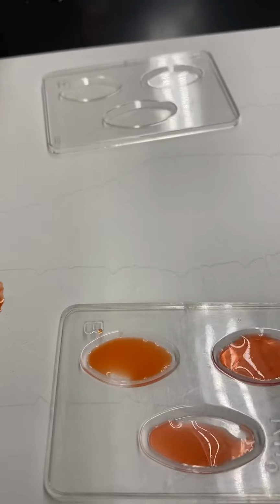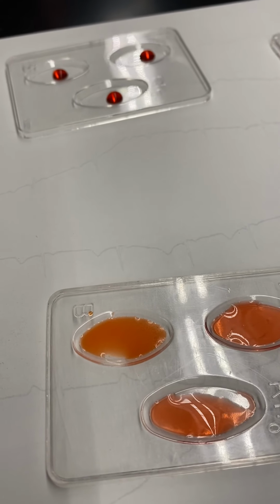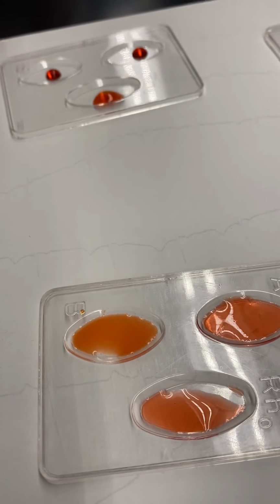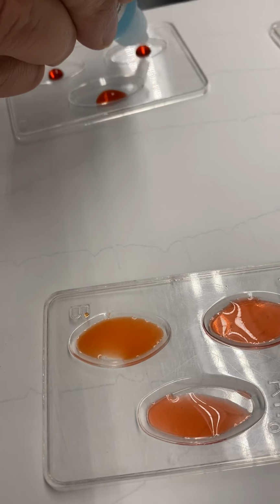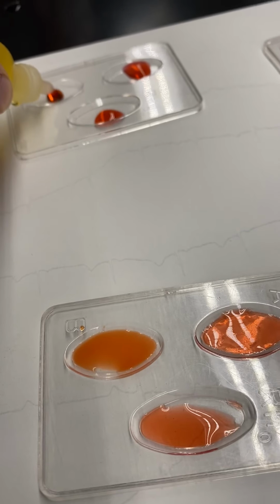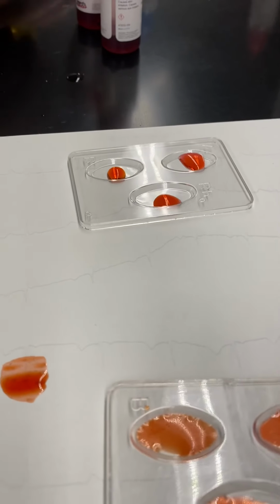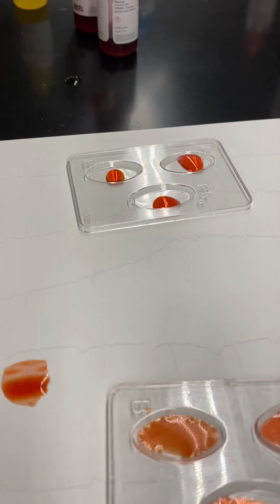And then lastly, we're going to do our last sample, which is Mr. Smith. Same process over. And by the way, I will make the pictures of these slides, this presentation, also available. So if you guys want to take a closer look yourself, you're welcome to do so.